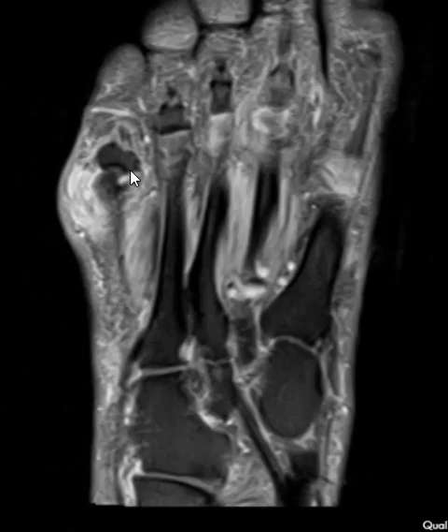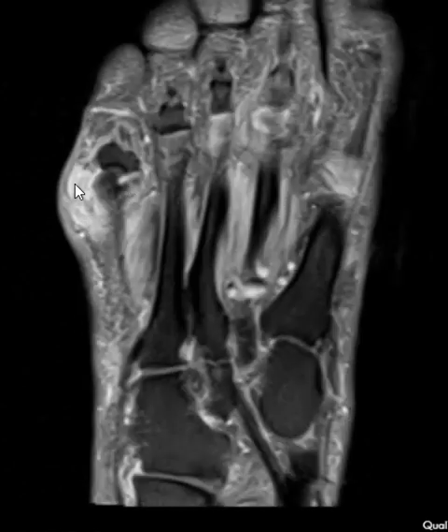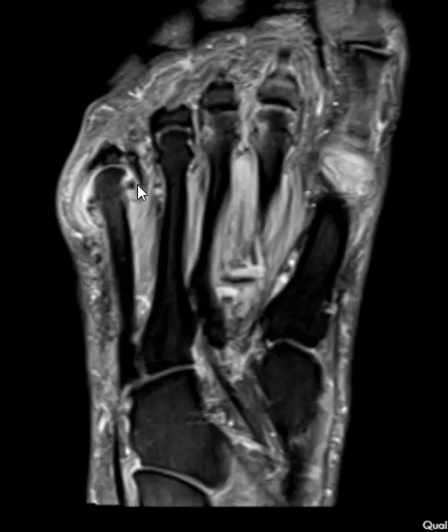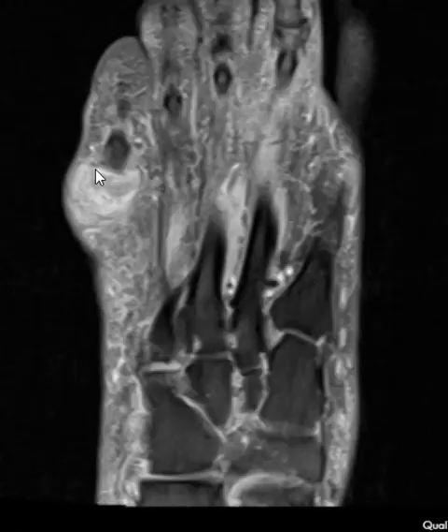The patient also has fluid distending the fifth metatarsal phalangeal joint with lots of edema around it — really striking fluid collection. They have a nonspecific synovial inflammatory process; it could be psoriatic arthritis or something else, but it is nonspecific.